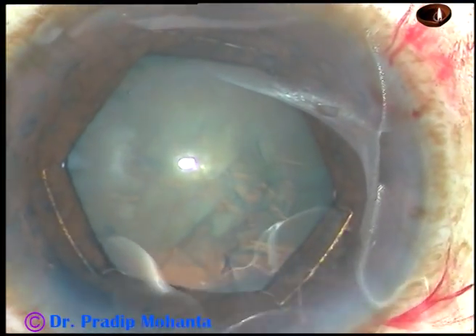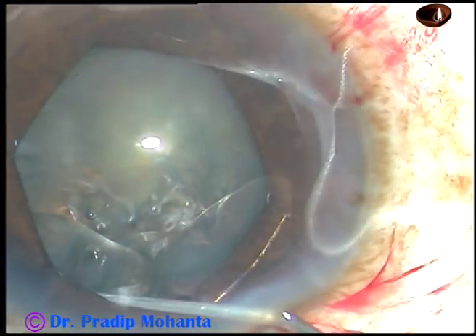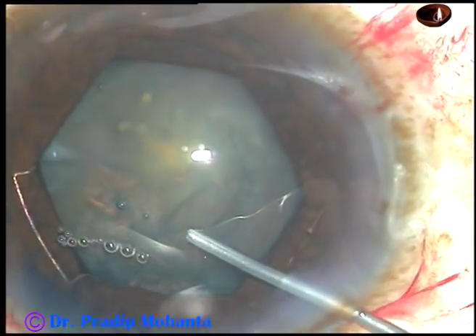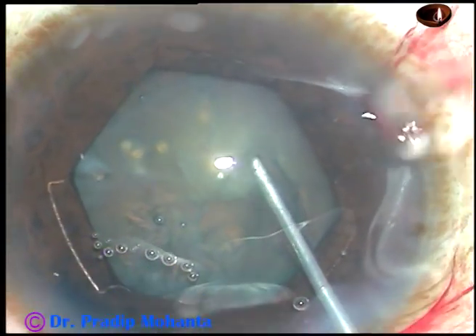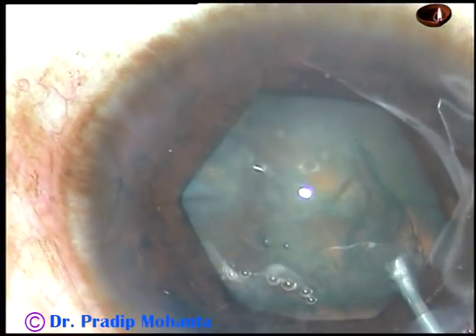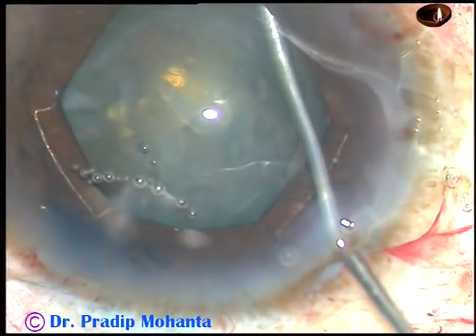Now hydrodissection is being done. BSS has been taken in a 2cc syringe attached to a 27-gauge cannula, and the fluid is being passed underneath the anterior capsular rim at several points.